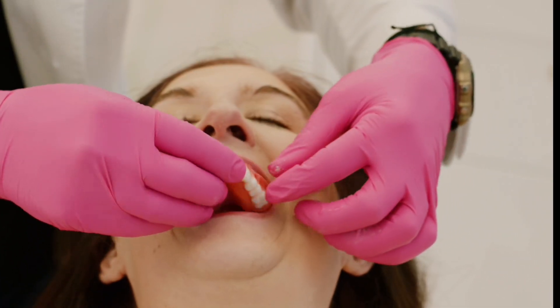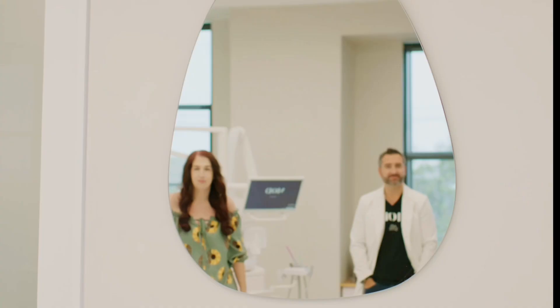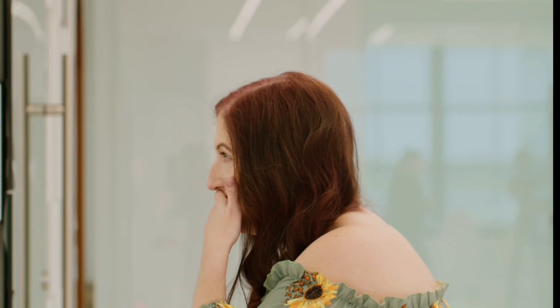And more importantly, they fit so nice. Patients find these more comfortable than when I was using border-molded custom trays. They find that the fits are better, and I'm also more happy with not having to do as many adjustments. I absolutely love doing these.